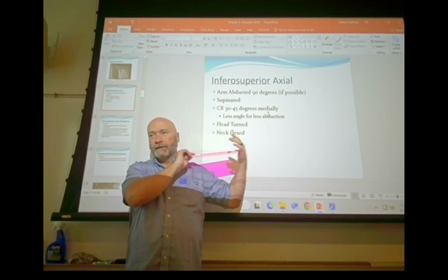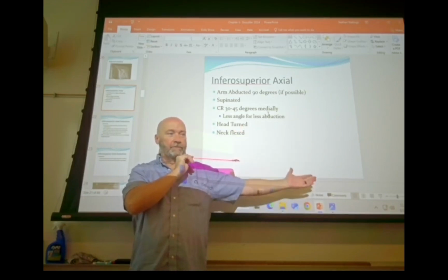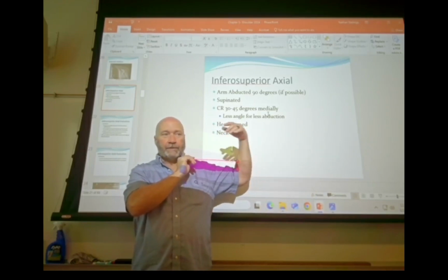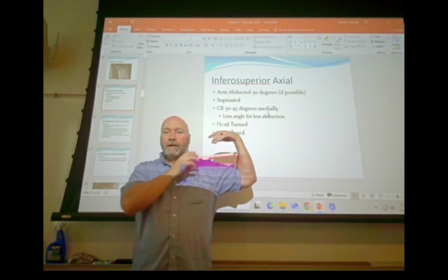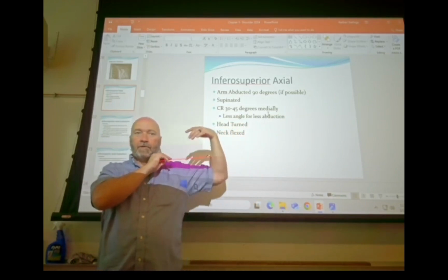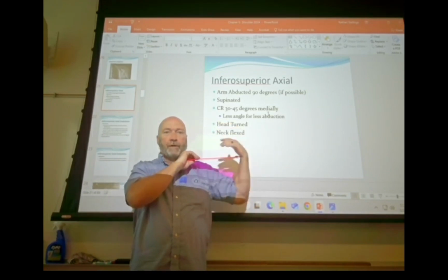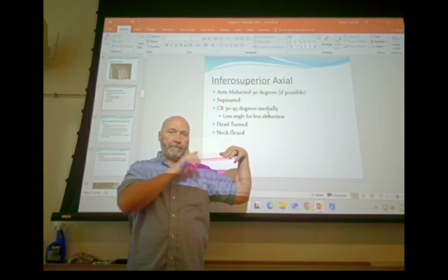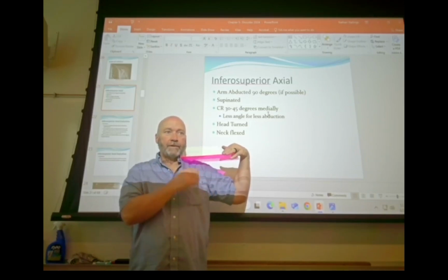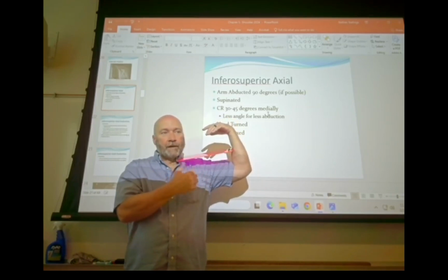So what you can do then is have the patient hold the image receptor, and you've not done really significantly anything, and just having the patient bend their arm. Now, the degree of your angulation is going to be dependent on how far the patient can abduct their shoulder. So if the patient can only pull their shoulder about that far, then your angulation may be more like about 20 degrees, as opposed to if they can come out, it's going to be more like 30 degrees.